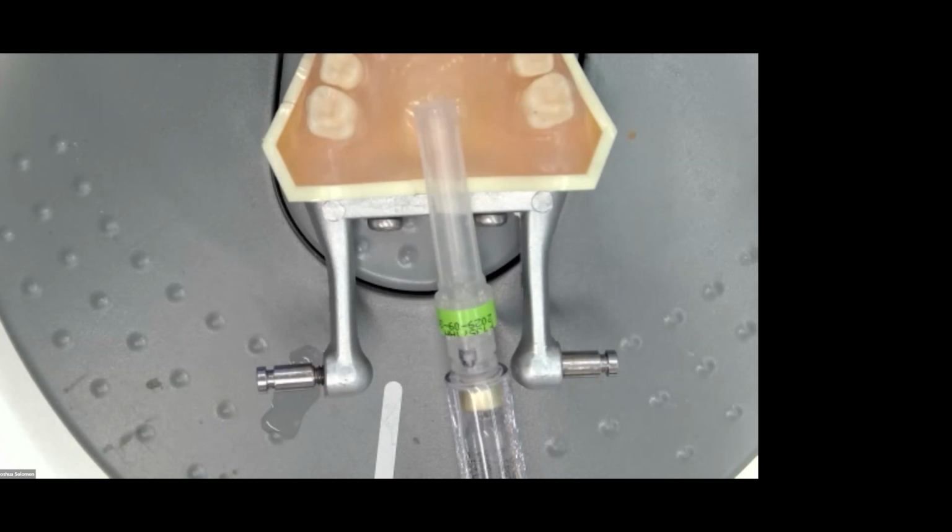Especially let's say if I'm placing zirconia crowns and I know that I'm going to irritate the tissue with my burr because I'm going subgingival. I will very often at the end of the appointment maybe just give a quarter carp. I go in the same hole just to prolong the amount of local anesthesia time that patient has.